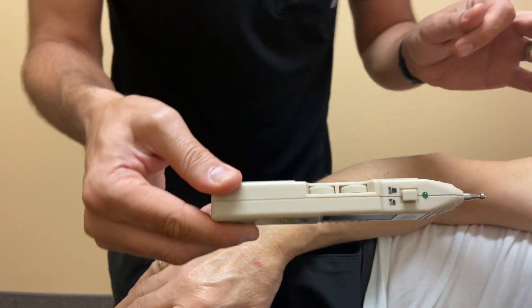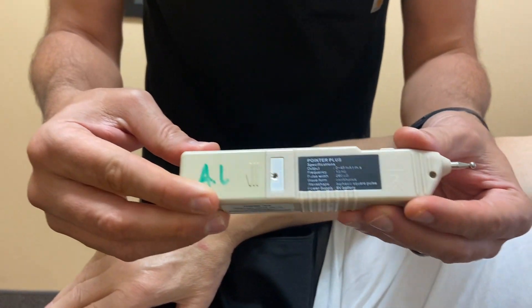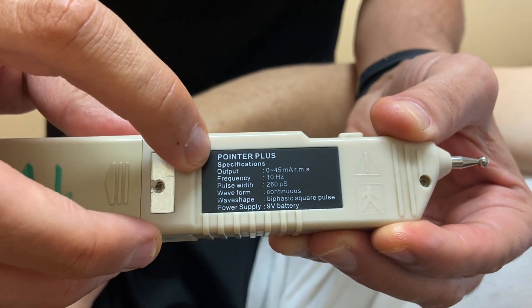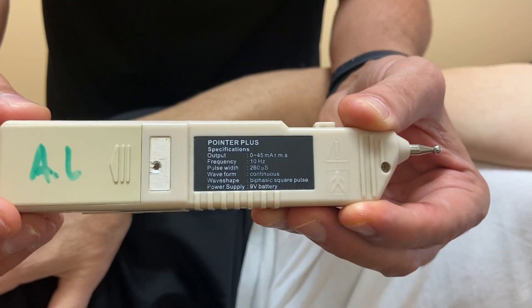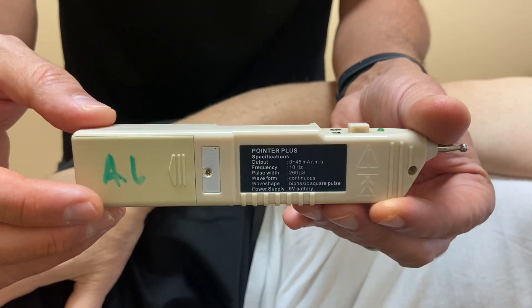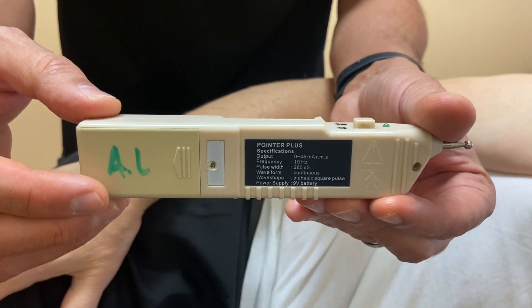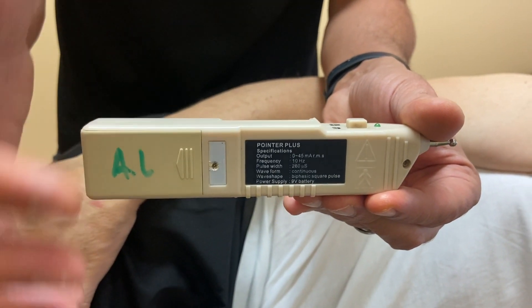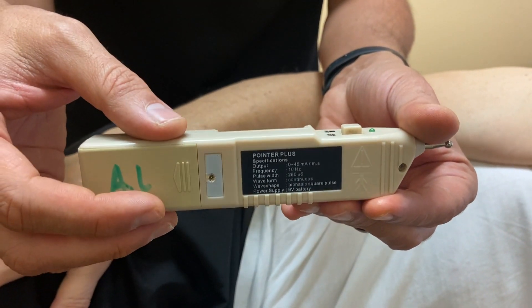In order to effectively activate muscles that are inhibited, the stimulation needs to be 10 hertz. You'll see these pointer pluses are preset at 10 hertz. Some are at 4 hertz and some have a variable dial, but the frequency needs to be 10 hertz.